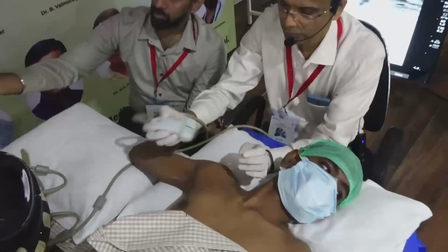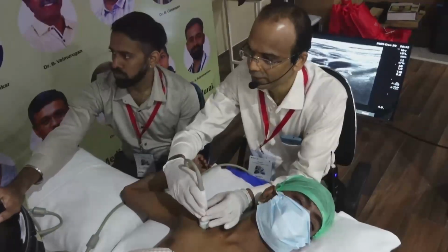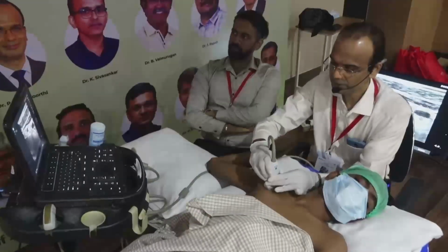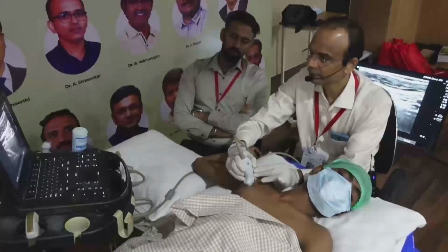As I told you before, if you have difficulty scanning this costoclavicular area, especially in a muscular patient, we have to choose the curvilinear probe in obese patients. So now I'll move on to the axillary area.